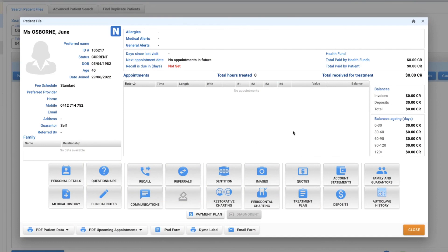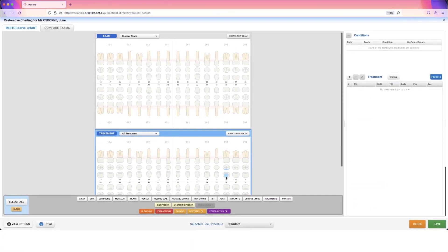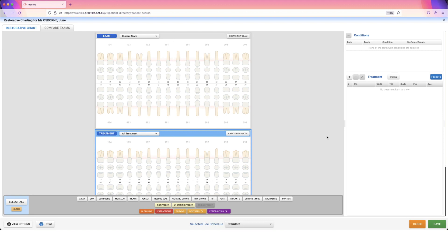This video shows you how to customize your restorative charting area. To start, go to any patient file and click on restorative charting. This view is the default within Practica, so when you first log in, this is what you're going to see unless you've already made customizations.